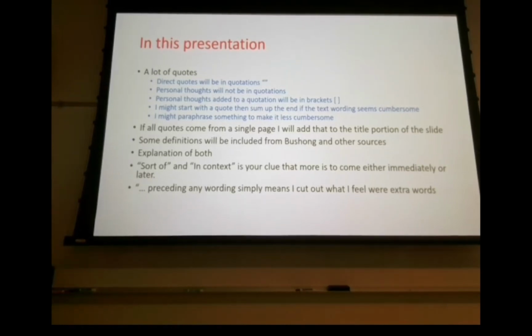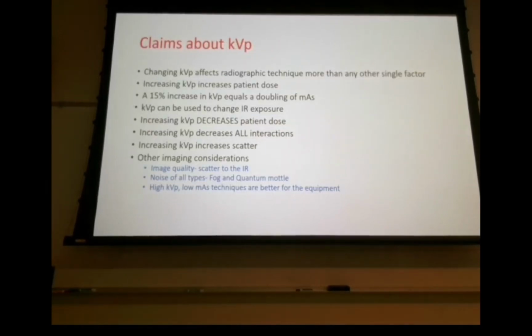Okay? So you can't just take something like "you increase kVp, you increase scatter." Well, it's true, but you got to understand why you're increasing scatter. All right? So, and we'll get there. All right, so claims about kVp, this is everything that we're going to be looking at.